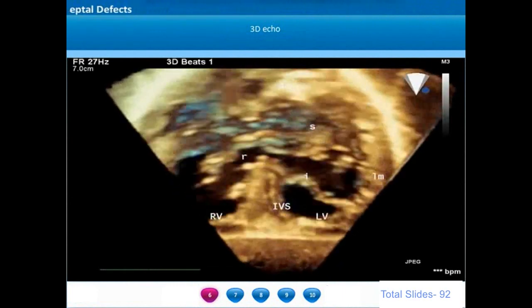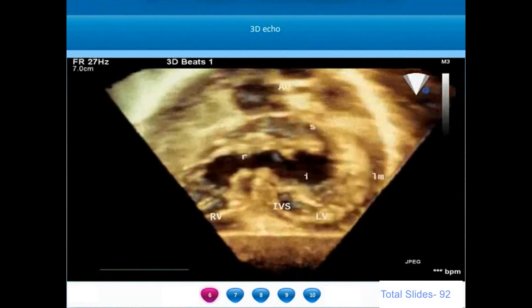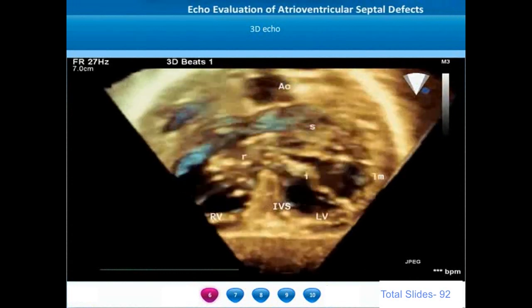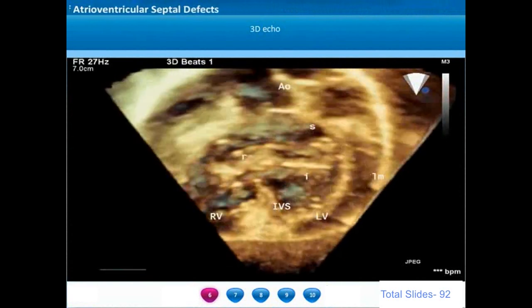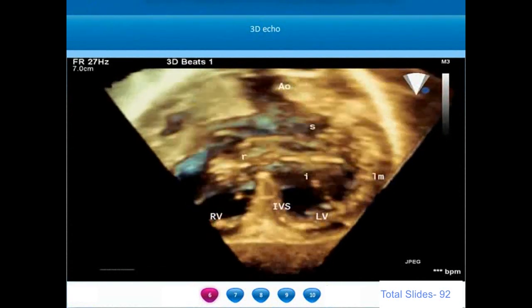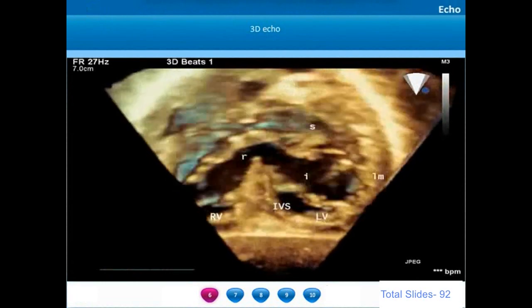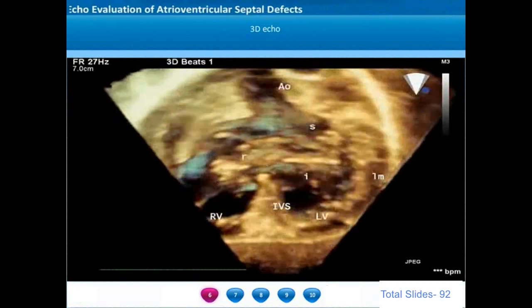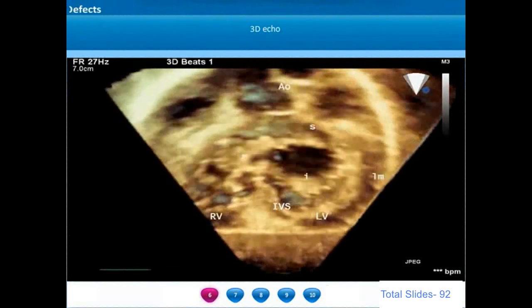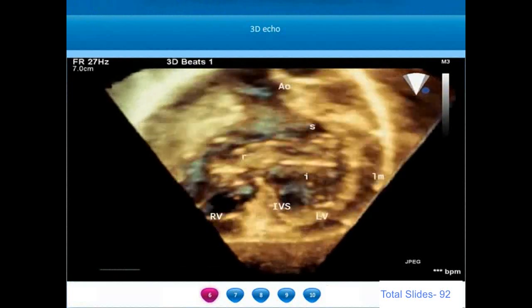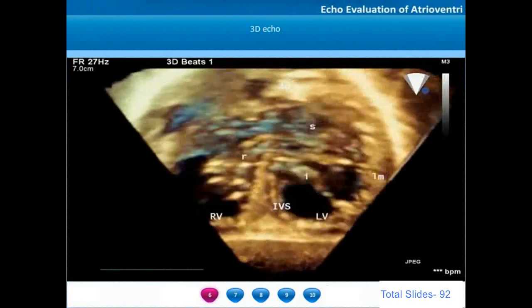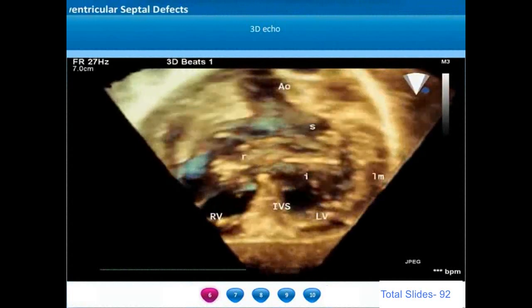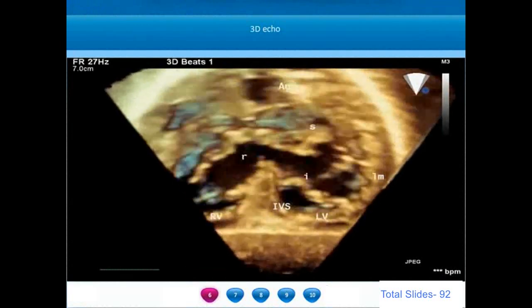The same view is demonstrated on three-dimensional echo here — a short axis view obtained from the subcostal window. We are viewing from the apex of the ventricles, having cropped off the apical and mid portions. The superior and inferior bridging leaflets are named S and I. There is a large inlet ventricular septal defect on either side of the bridging leaflets. The left mural leaflet is shown on the left ventricle and the right-sided AV valve orifice is shown as R.